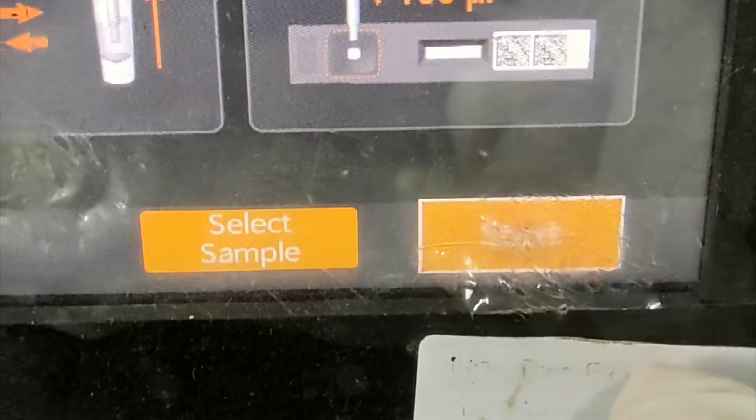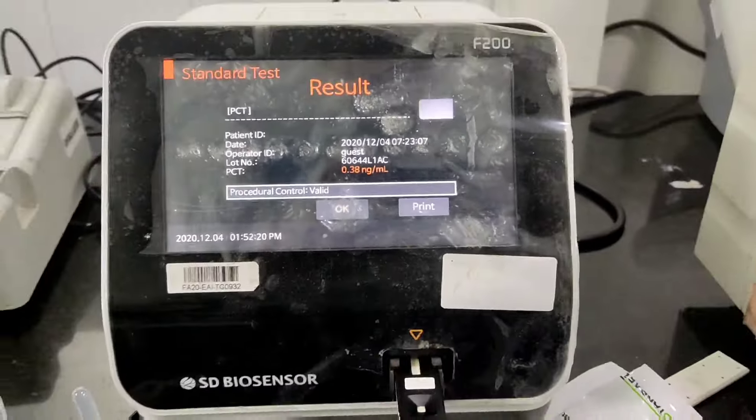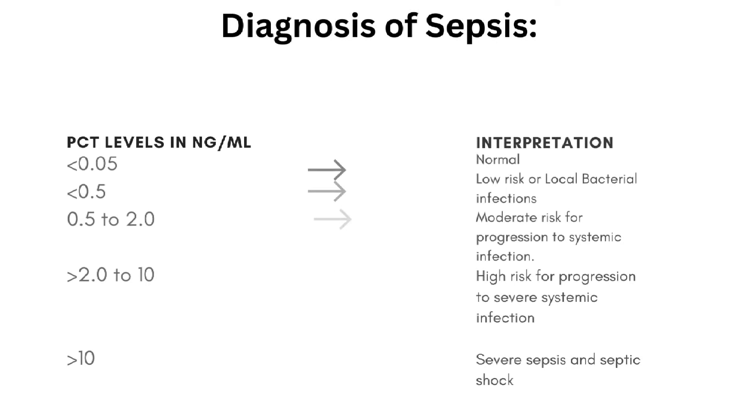As displayed by the procedure, we aspirate 100 microliters of sample and mix it with the procalcitonin buffer. Mix the sample and buffer two to three times with the disposable dropper. After adequate mixing, apply 100 microliters of the mixture to the sample pad and press the start button. Do not put bubbles in the sample well of the test device. It will take around 15 minutes to display the results.